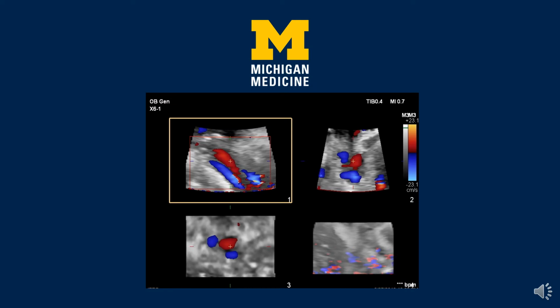The image of interest is the one in the lower left-hand corner. This is called either the C-plane or C-surface, and it demonstrates the umbilical vein and the two umbilical arteries, but it displays them as if you're looking right down the length or the barrel of the ultrasound beam, and the position produces a surface at constant depth from the transducer. If you take every small area element in the umbilical vein and multiply it times the detected velocity at that point and sum those up, that is volume flow, and that corresponds to the Gaussian surface method.